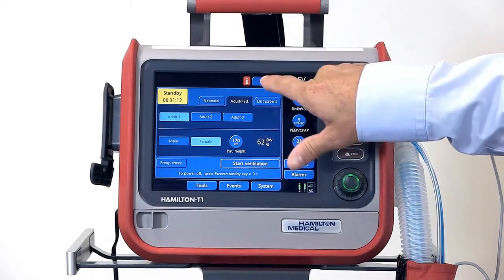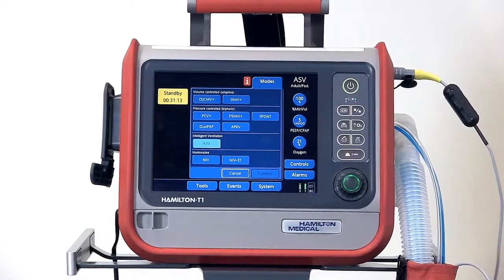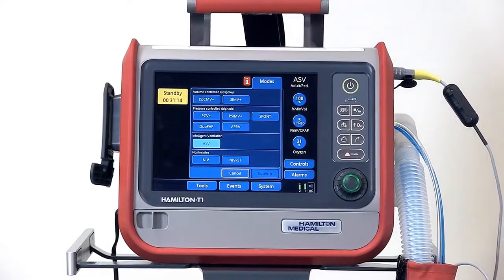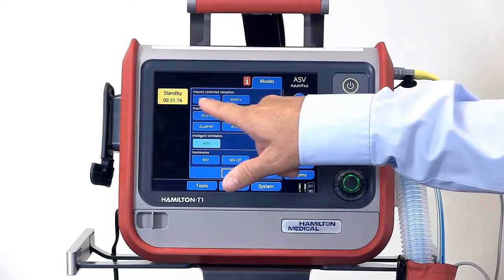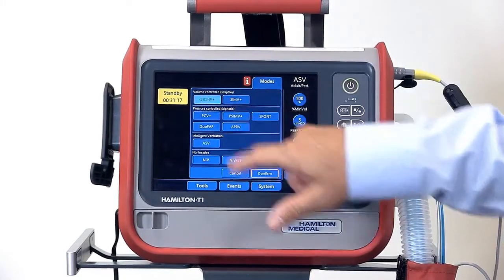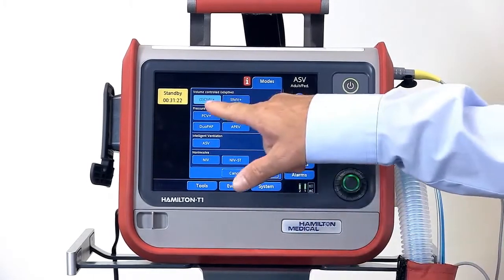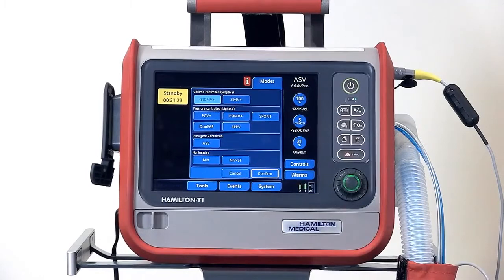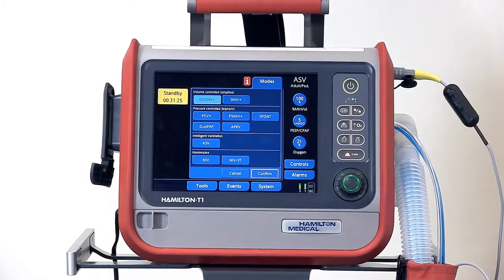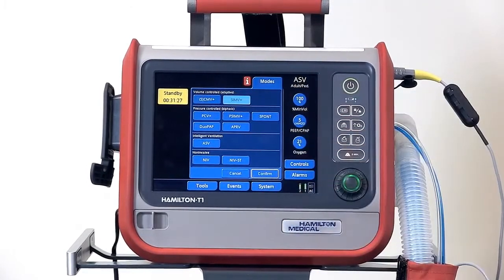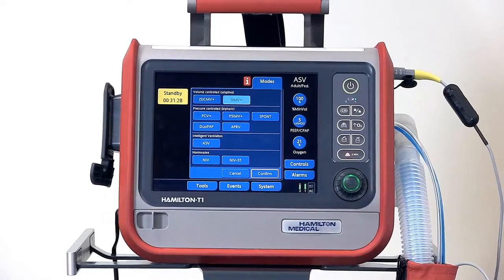Next, touch the modes tab to enter the modes menu and select your mode. In the top section, we have volume controlled adaptive modes. First is synchronized controlled mandatory ventilation, and next is synchronized intermittent mandatory ventilation.